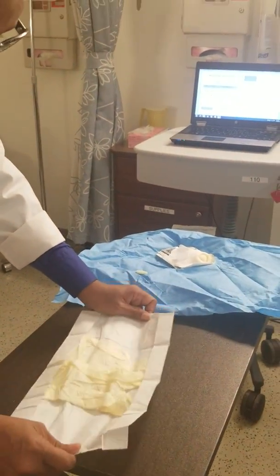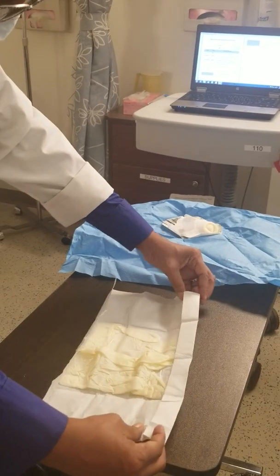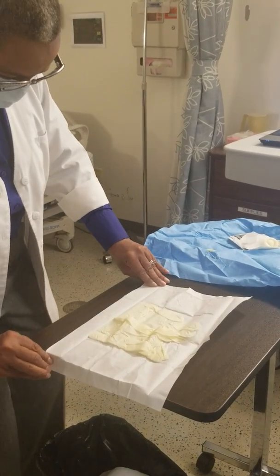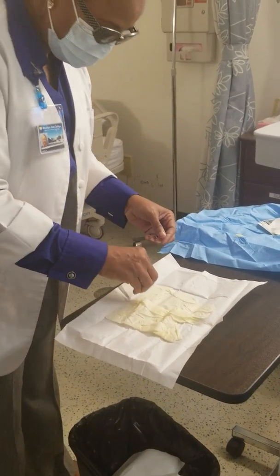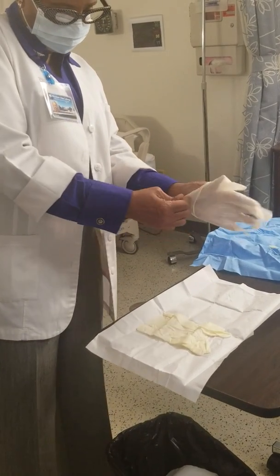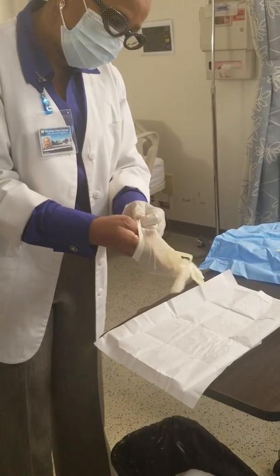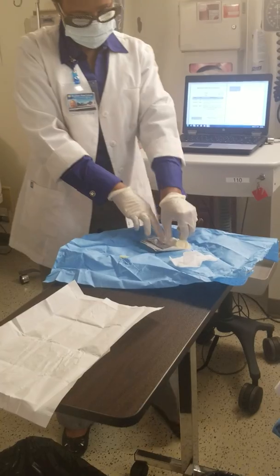Put your gloves on. Everybody's pretty cool about putting gloves on now. Y'all know y'all got that shaking going on, especially when you're putting that cannula. Okay, so what is this? Is this a dominant, non-dominant hand on? It goes like this. So guys, if you need bigger sterile gloves, just make sure you bring them. So now I can go in here and play with this all I want.